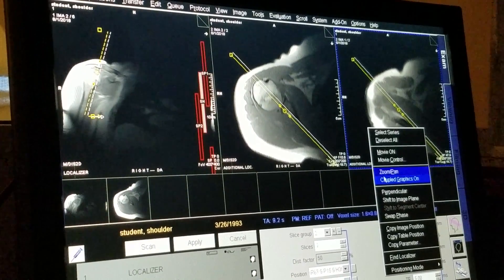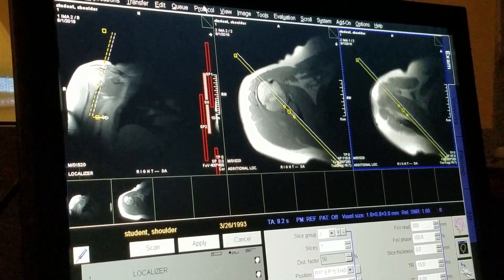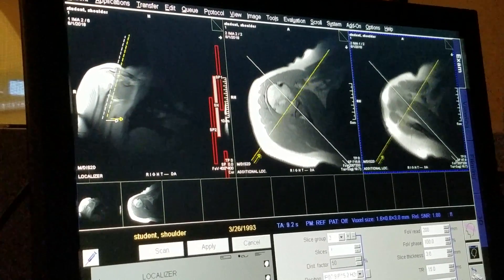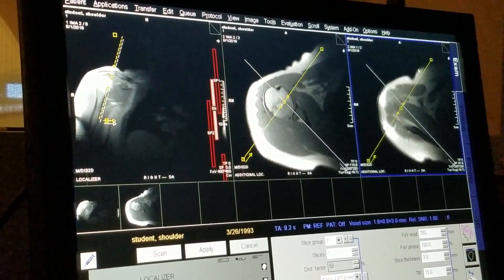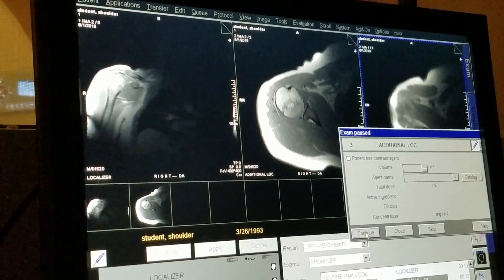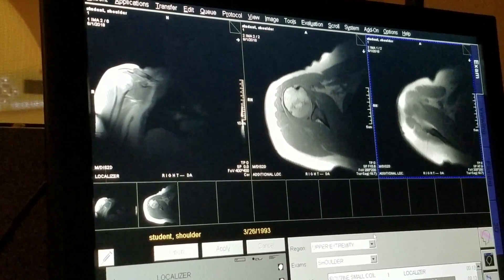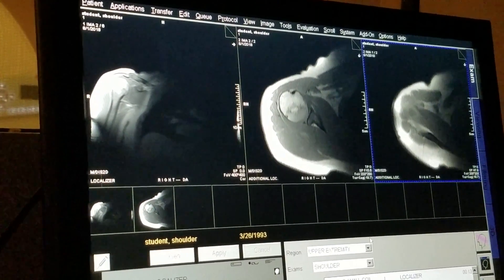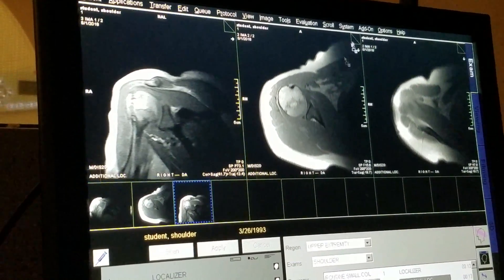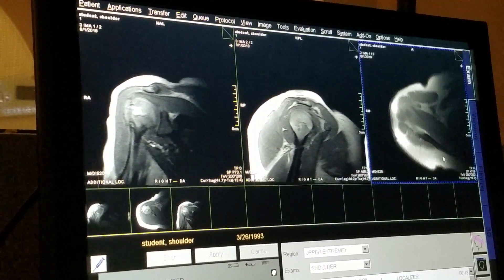Right now it's perfect — you do not want a check mark next to it. So as long as that's the case, make sure the slice group you added is still selected. You're going to go to Protocol, Turn Group — that'll make it exactly 90 degrees. So now you have a pseudo-coronal and a pseudo-sagittal. We're going to run that now. Here's the pseudo-coronal, here's our pseudo-sagittal, and here's our axial localizer.